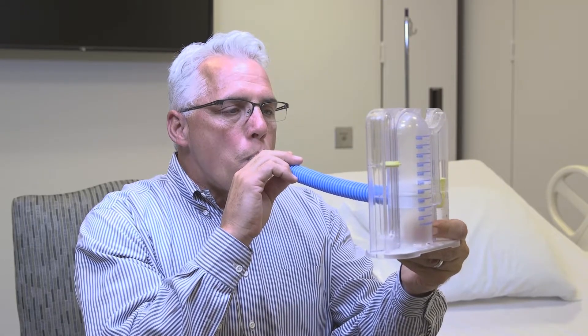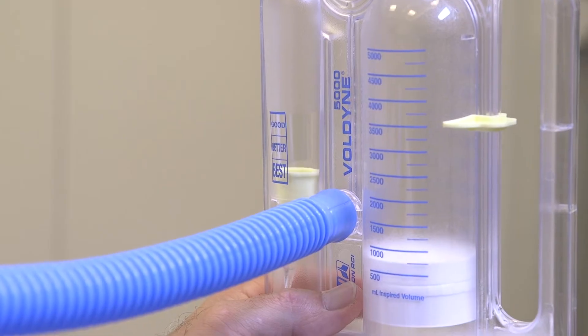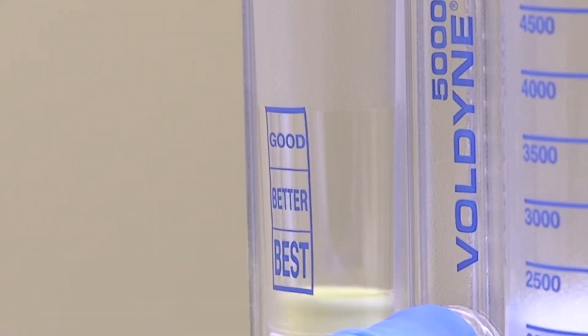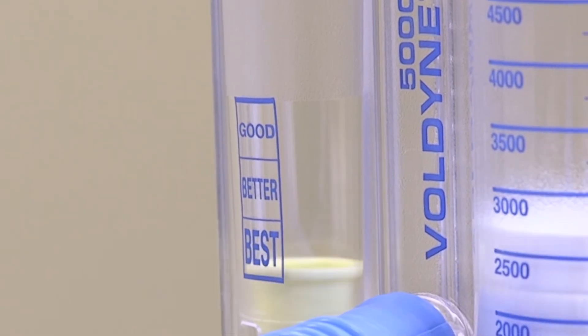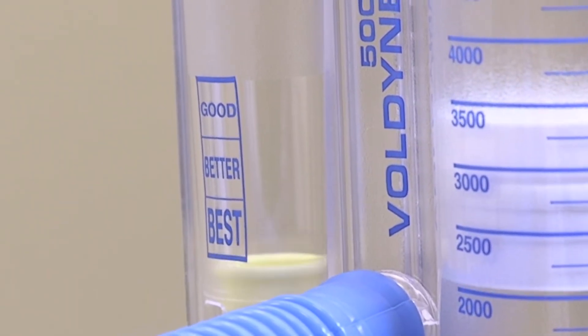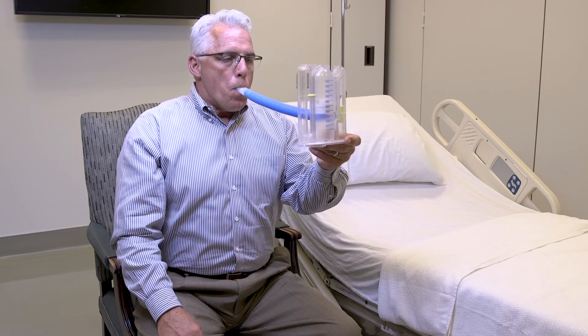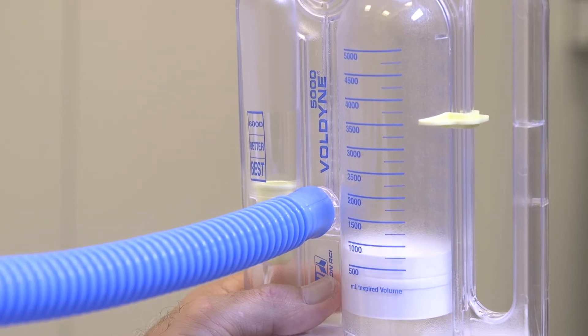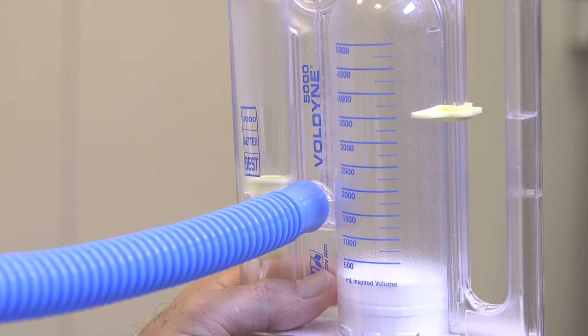Try to keep the flow indicator in the better or best position throughout your breath. If the flow indicator doesn't stay in the better or best section, you are breathing too slow or too fast. At the end of your inhalation, try to hold your breath for 3-5 seconds before slowly breathing out. Let the white piston fall all the way to the bottom in the resting position.